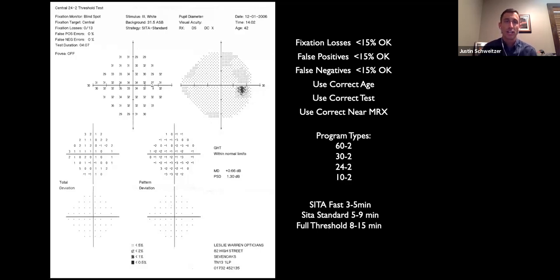So another question that came up: how would you test for visual field loss with someone who is nonverbal, unable to test? You know, for a confrontational field, that can be challenging. You can definitely have them, when you bring the bead in, give you hand signals. So you can say, when they can see it, they can give you a 1, or just put a finger up, whatever you want to do there.